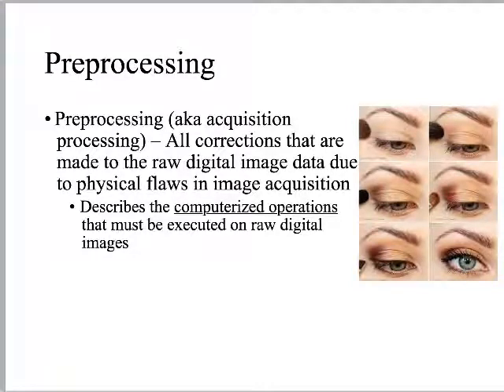These post-processing operations, these lipstick-type operations, are a major advantage of digital imaging as compared to film. When we were shooting film, we could not do this stuff. We could not change contrast. The contrast was whatever you got. Whatever you got on your picture, that's the contrast you got. If you didn't like it, if it was too dark or too light, guess what? You had to hold it up to a hot box.